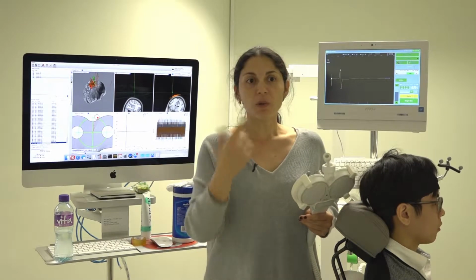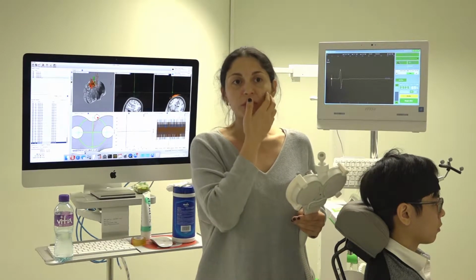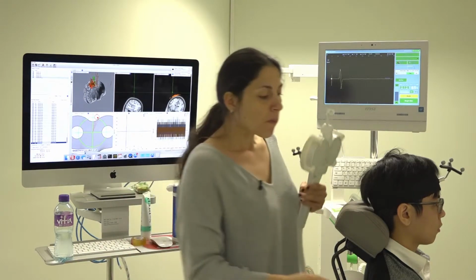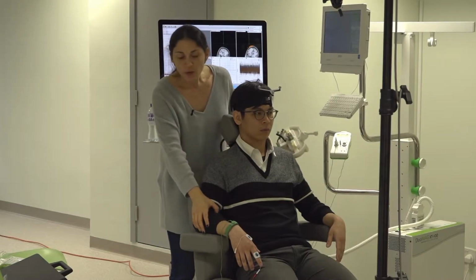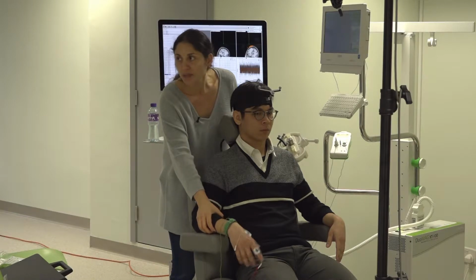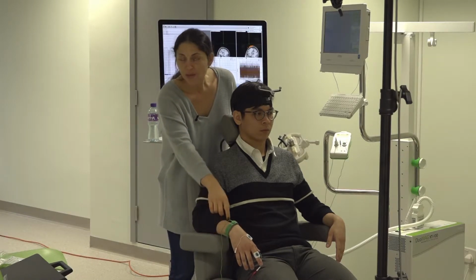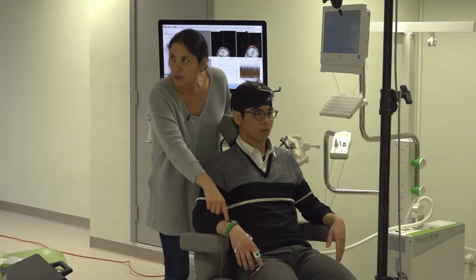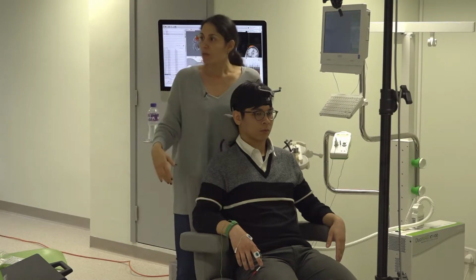We will do this demonstration about the resting motor threshold and active motor threshold, and with this you can do any study now. Motor threshold, the resting one, is with the muscle at rest. I prefer the hand relaxed like this, without any type of tension.